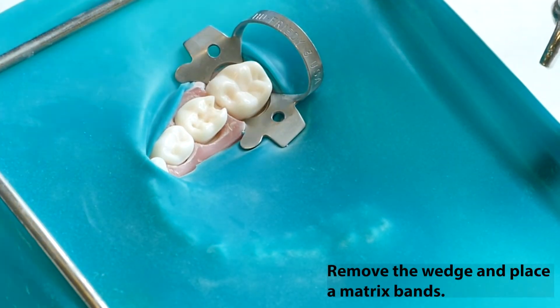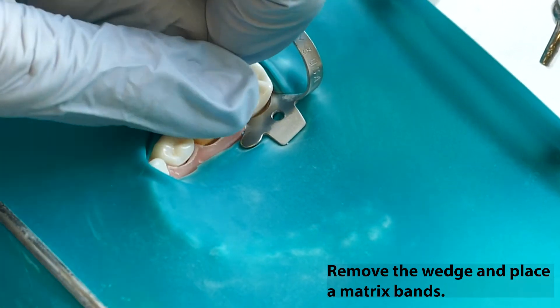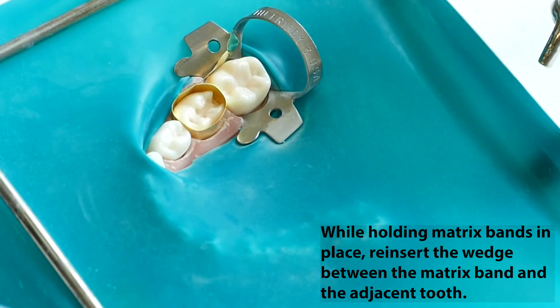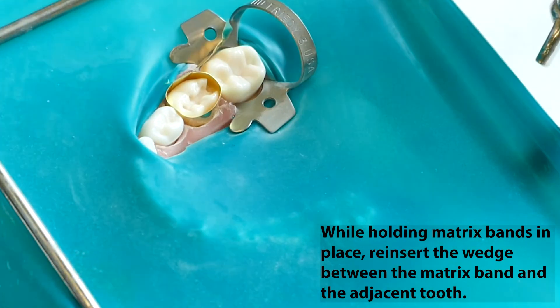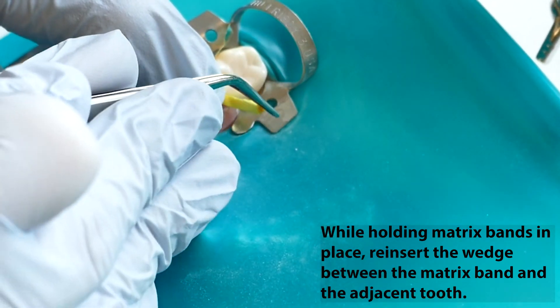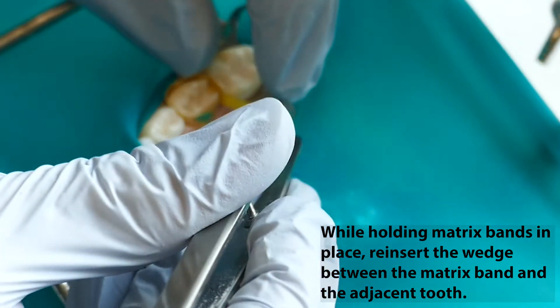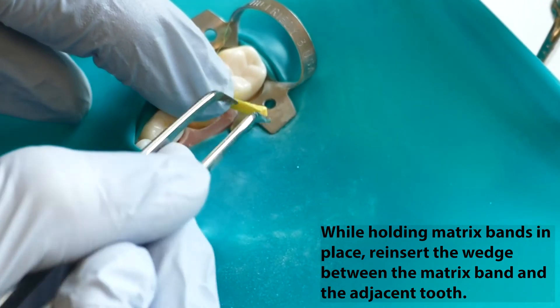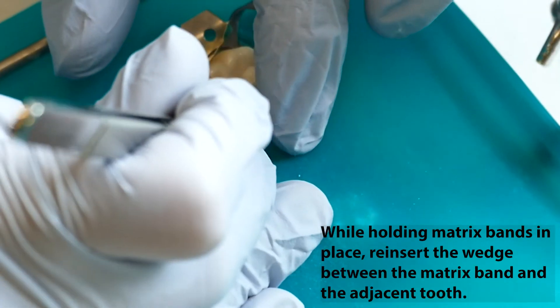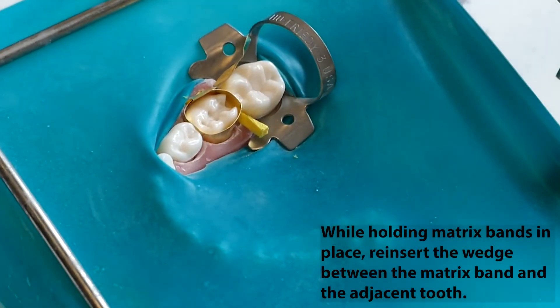Remove the wedge placed at the beginning of the treatment and place the matrix band. While holding the matrix band in place, forcibly reinsert the wedge between the matrix band and the adjacent tooth beneath the gingival seat of the preparation. The wedge is placed with a pair of Howell pliers or cotton forceps from the widest embrasure. The wedge should hold the band tightly against the tooth but should not push the band into the proximal box. It may be necessary to trim the wedge slightly to achieve a proper fit.